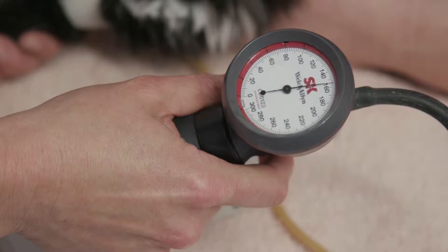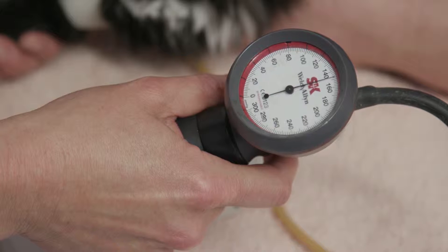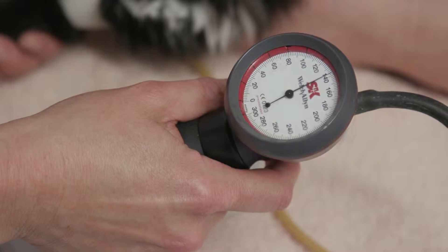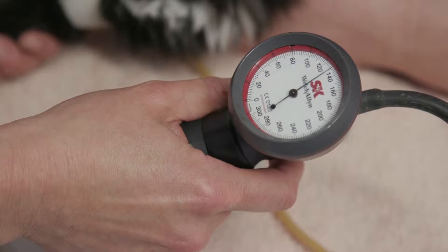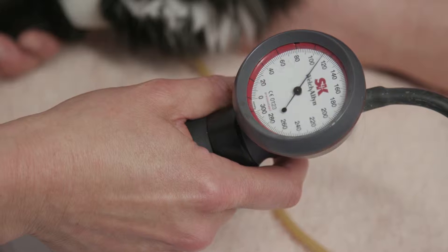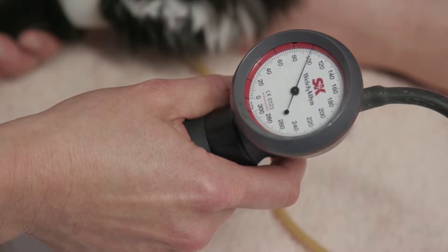If you inflate a little bit above that point and then slowly start to deflate that cuff, all the time looking at your pressure gauge, listen very carefully for the point where the pulse is first clearly audible — and that is your systolic blood pressure reading.